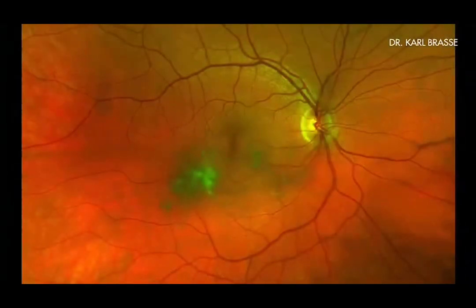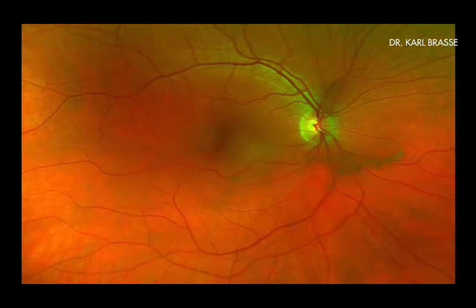Here you get to see a large floater cloud fixed on the optical axis. This type of group 3 floater is very much debilitating the patient. He does not just suffer from the floater but from a permanent visual impairment as well.